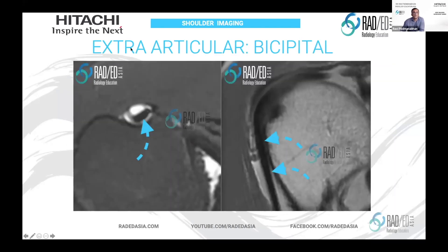The third part is the extra-articular portion, which is really assessed best on the axial scan. This is an axial image cutting through the tendon, and you see it really nicely. You can at times see it well on the coronal images as well, but I wouldn't rely on those for signal — it's the axial images that you want to look at.